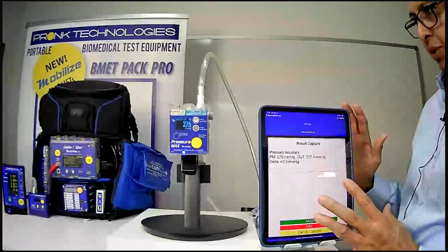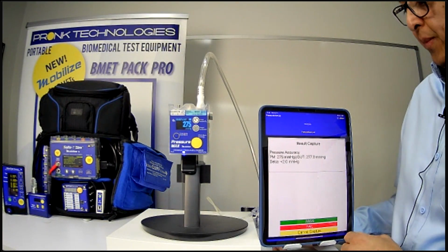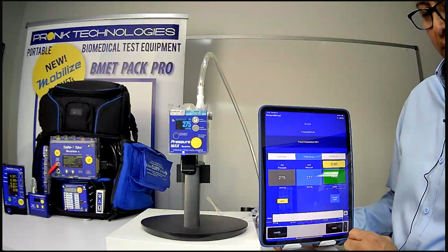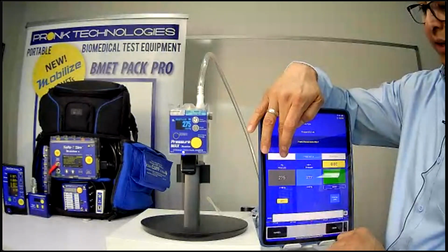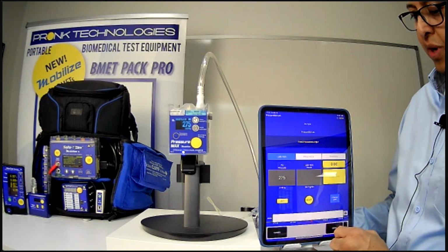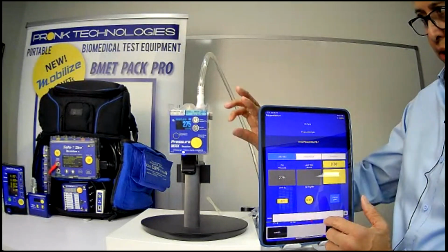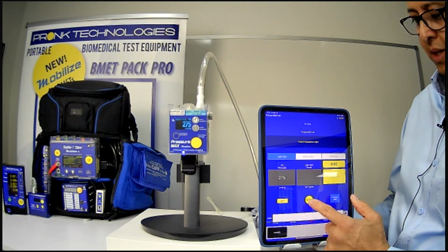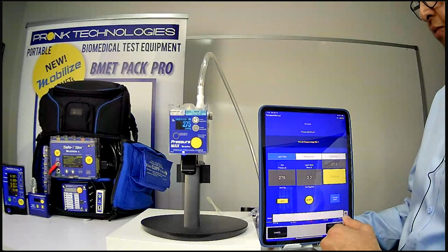So here, I'm able to do all the work I need to, utilizing the Pressure Max and capturing that data into the report itself. If I wanted to do a leak test, I go over to leak rate. I can inflate to the particular pressure I want, and then you can start the leak test here. So once you know your pressure is stabilized in the Pressure Max, on the medical device, you have it connected, you can start the test here to start measuring a leak rate.